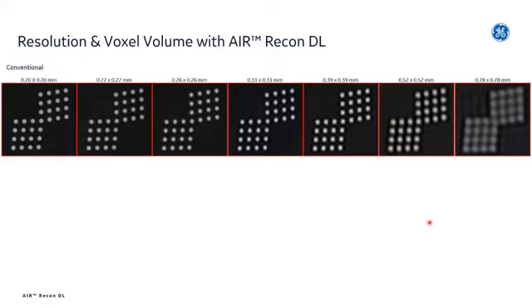So here's an experiment that we ran on a similar type of phantom, where we imaged the same structure. These are just basically line pair phantoms of a fixed diameter. They're the same structure in all of the images I'll show you, but we acquired them with varying in-plane resolutions, and that ranged from 0.2 by 0.2 millimeters all the way up to about 0.78 by 0.78 millimeters. With conventional reconstruction, you can see that maybe the leftmost image seems to capture the edge information the best, and that's as expected. It's the highest resolution image.